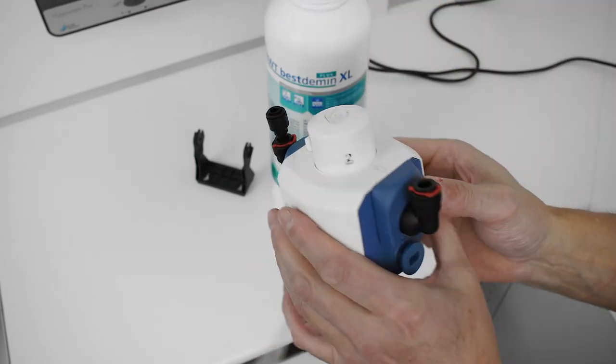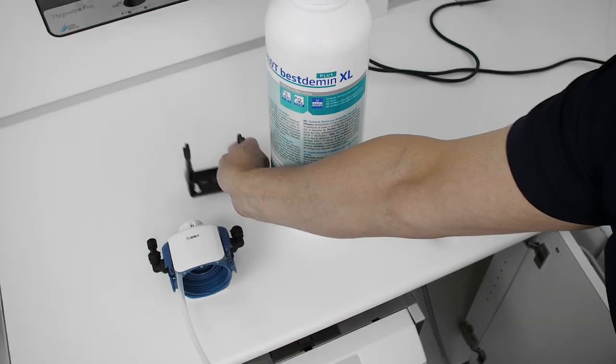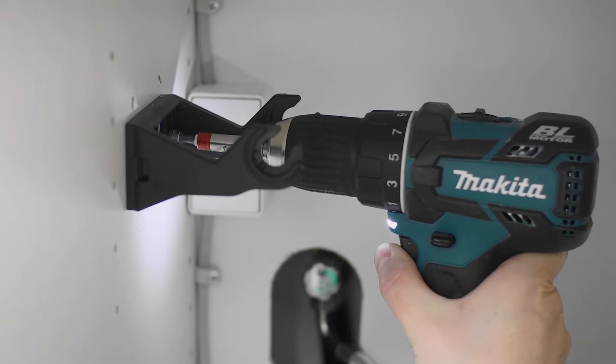Switch the bypass function from position 2 to position 0. Mount the black wall bracket onto the wall. Make sure there is enough headroom for the white filter head.